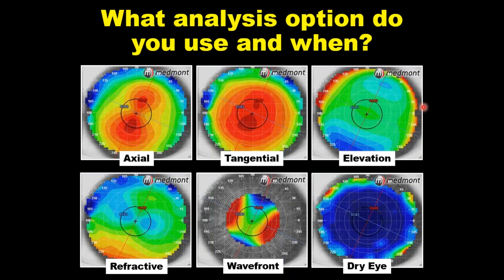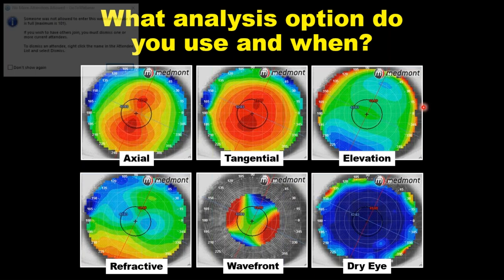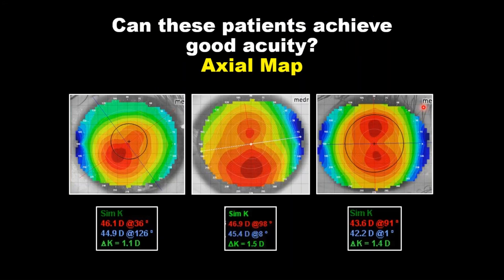When you receive your corneal topographer, you'll notice there are many ways to analyze the images it takes. With Medmont — and any Placido topography — we are working with different maps, as you can see there. Each one gives us a certain type of information. There are six maps available specifically at the Medmont level.